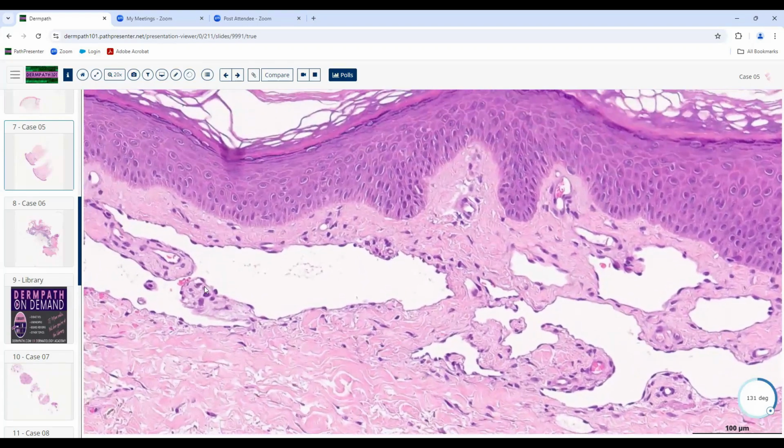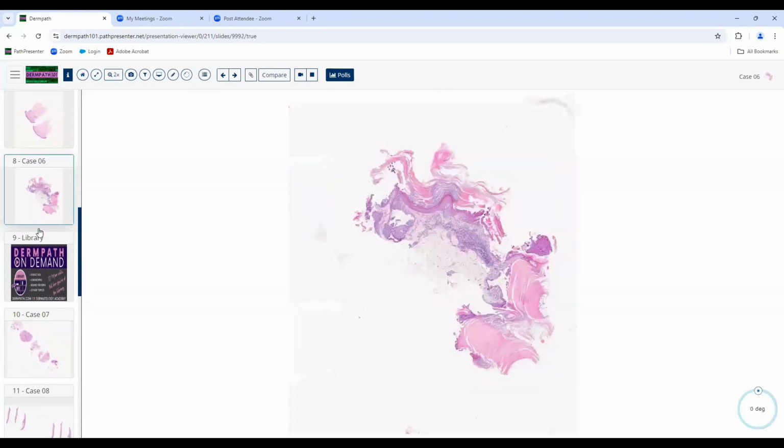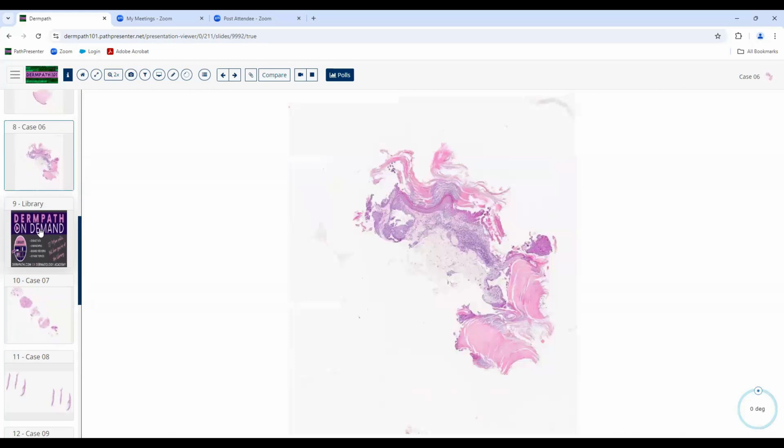And the other situation where you can see that same sort of histology is in Kimura's disease. That's where you get multiple widespread lesions, not just in the head and neck area, often seen in Asian individuals. But the biopsy looks pretty similar to the histology of angiolymphoid hyperplasia with eosinophilia. And that one you very well could see on the board. That's one that's a little bit more prototypical. So we'll show you an example of one of those one of these days as an unknown in this session. So you'll have a chance to review that, but I would recommend knowing a little bit about that.